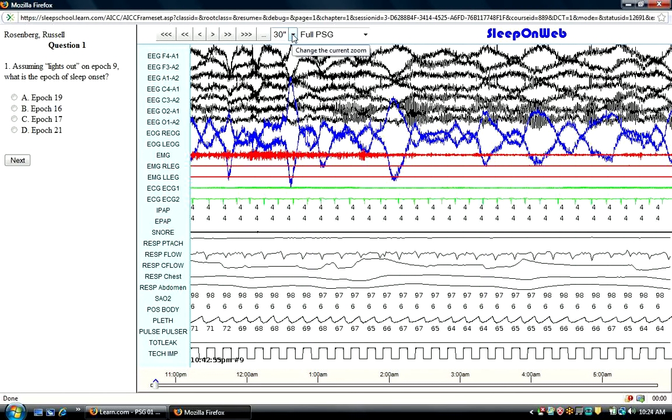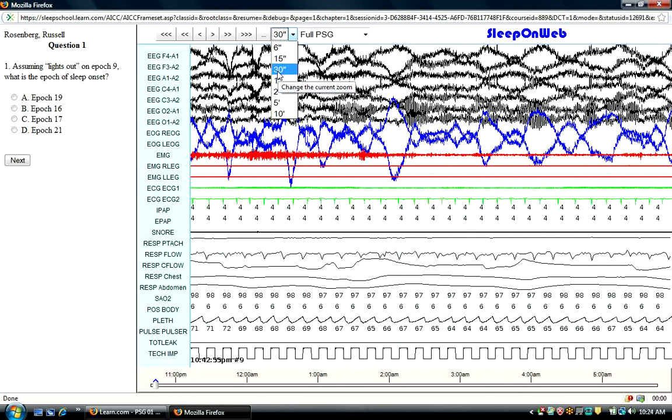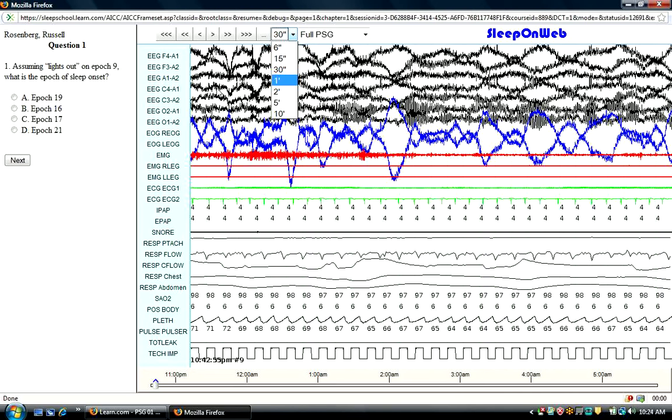Now, you have the capability also of looking at different screen sizes or times. Here, you can go from 30 seconds, which is standard for scoring, as you may know, all the way up to 10 minutes.